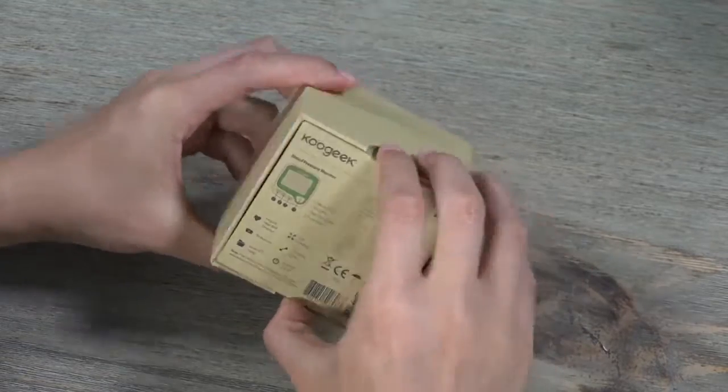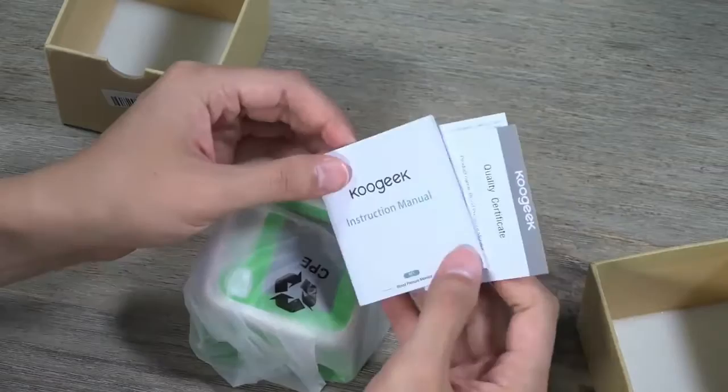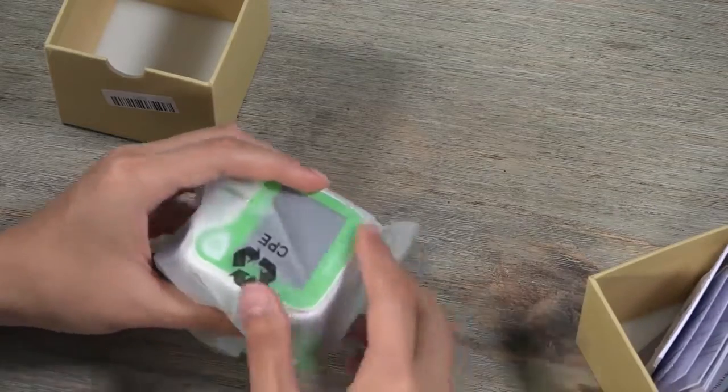It also has a jumbo LCD display. Let's just jump into the device. The instruction manual is in English.